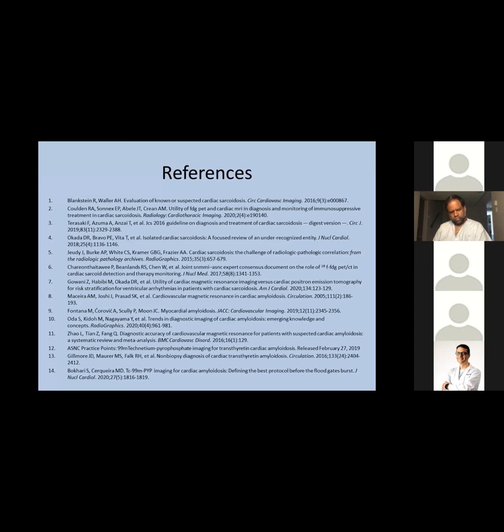There are also newer sequences coming through regularly that enable faster imaging, so we can further decrease the imaging time, and we're gradually doing that. So I think there are a lot of indications for MR that are underutilized, but part of it is capacity and how long you're willing to wait. But I think that has been improving a lot lately. So I hope that we'll have further increase in capacity over the next year or 2.